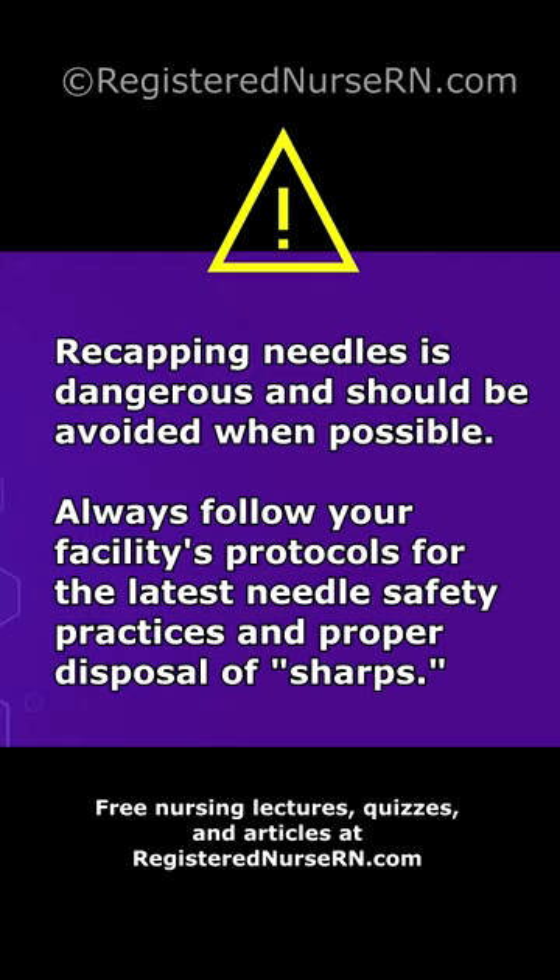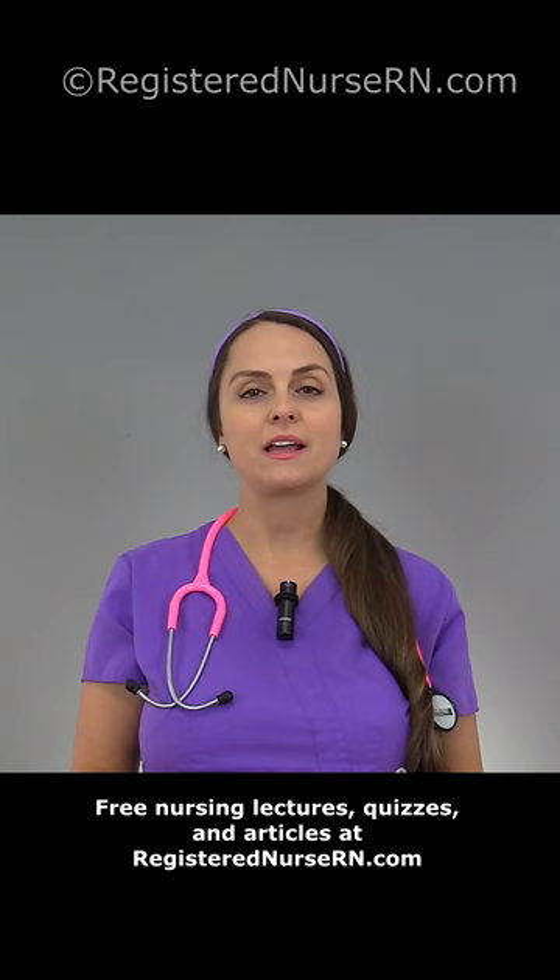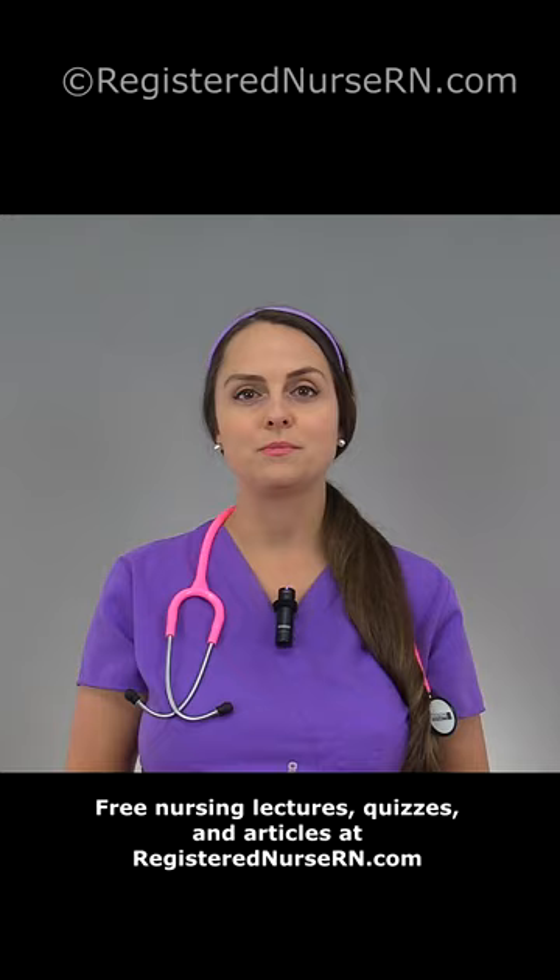However, sometimes as a nurse you have to recap a needle. You'll want to avoid using the two-hand technique as it carries a much greater risk for a needle stick injury. Therefore, it is recommended that when you do have to recap a needle, you use the one-hand scoop technique.